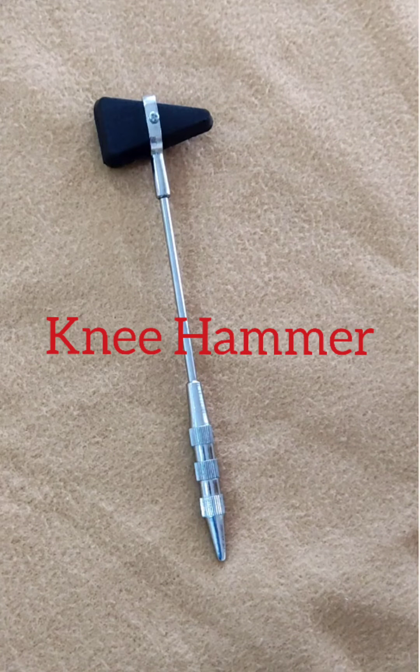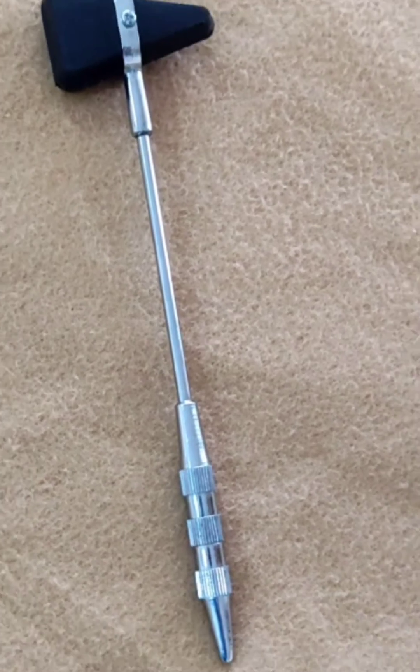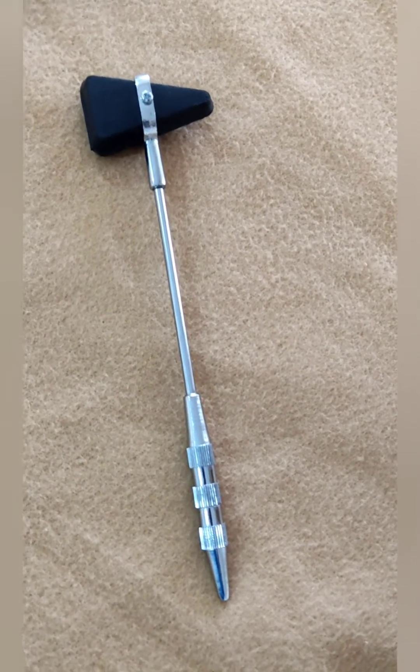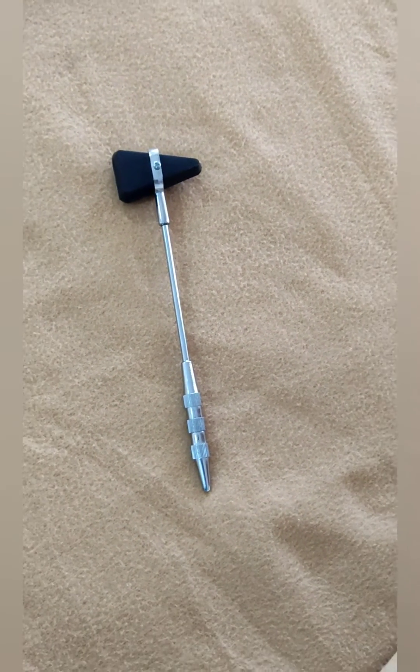Hello all, let us see a brief description of the knee hammer. The knee hammer, or neuro hammer, is a medical instrument that is used by doctors and medical practitioners to test deep tendon reflexes.